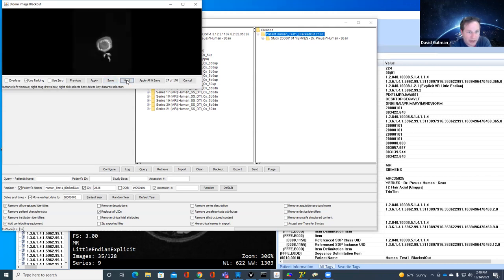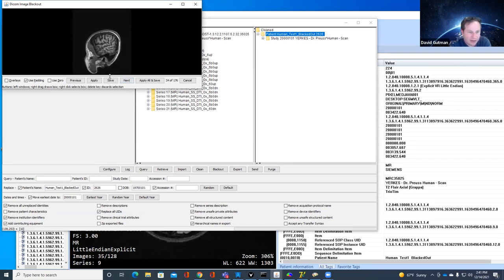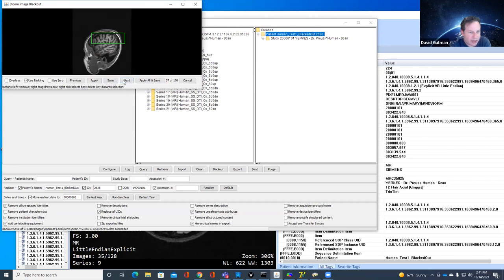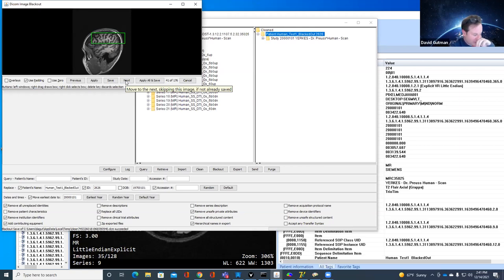I can now do blackout. This tool is actually relatively user-friendly. I'm going to get to a part of the image where there's something to look at, and I'll pretend that part of the image is problematic. Fortunately, the blackout square gets applied to every next slice in that series, because you can imagine drawing 176 boxes would go over badly.